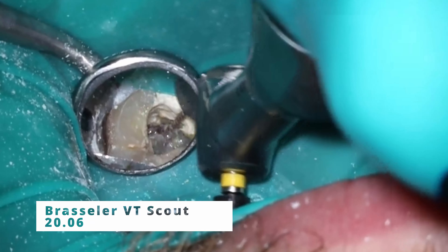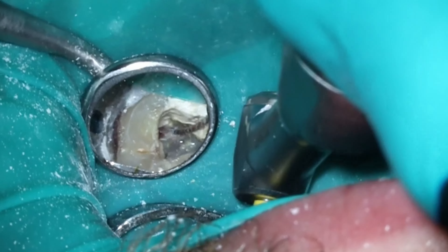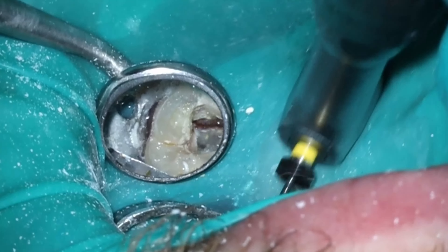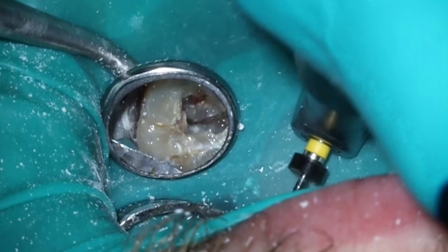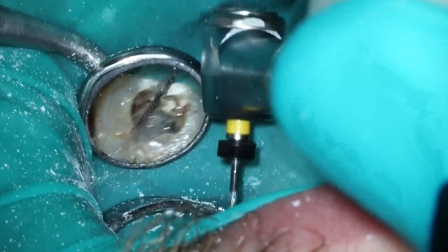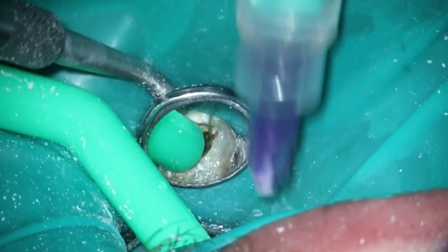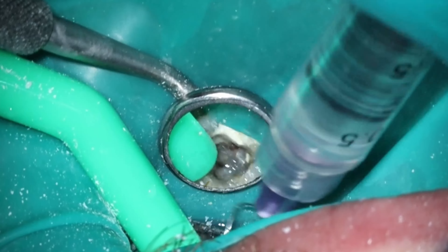At this point I'm going to open up the MB2 a little bit more using that 2006, give me a little bit more space, because oftentimes with MB2s they're going to join. I like flaring before I get length, because there's usually going to be some more discrepancies in the actual length itself. But here we are — I think at this point we're almost at length. One take, baby, we're gonna get this done. So let me rinse this out here, and I think length is coming up after this.